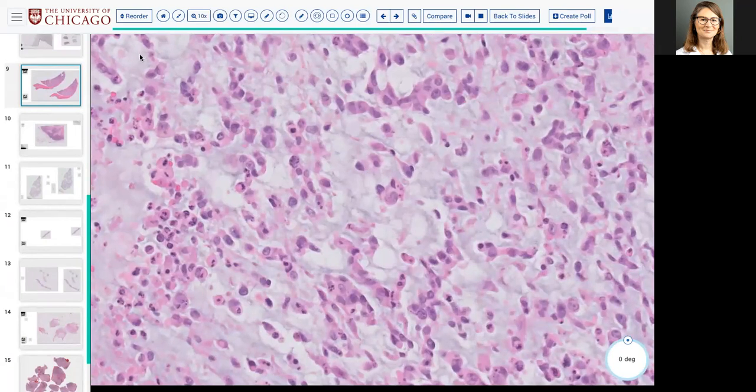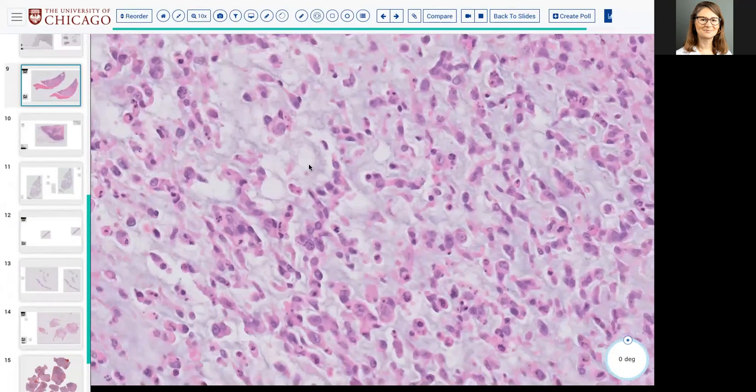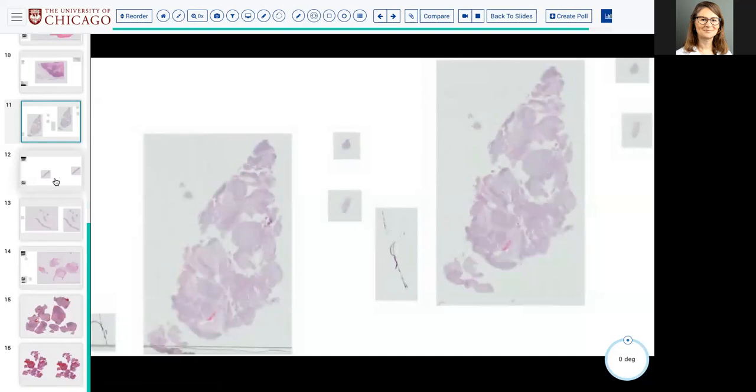That was one of the first ones we saw that had these very plump cells with eosinophilic cytoplasm, but this very characteristic myxoid background. So I wanted to shift the thought process now to tumors that either had a myxoid or perhaps chondroid background, and continue that exploration of these cases.